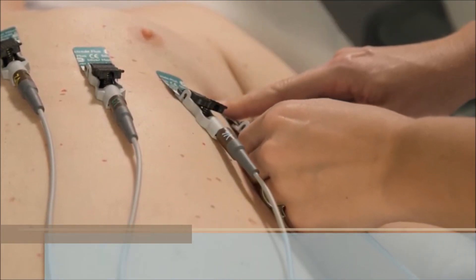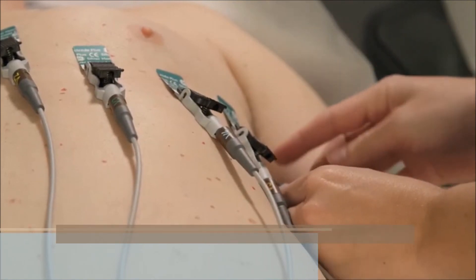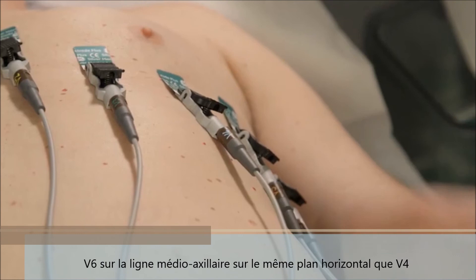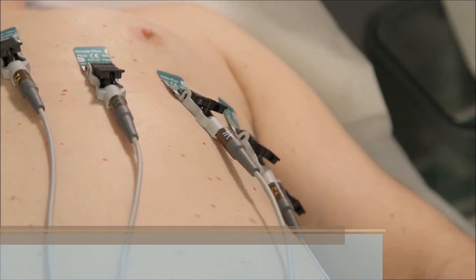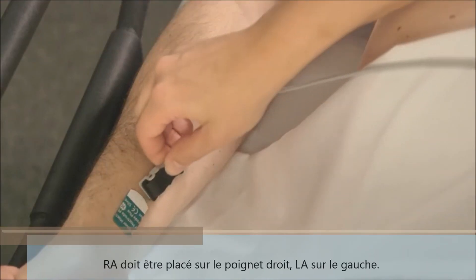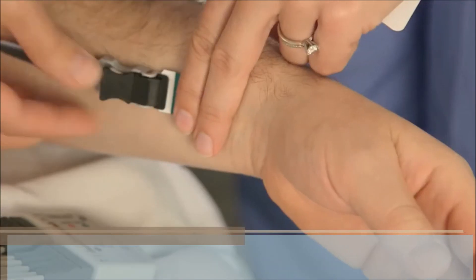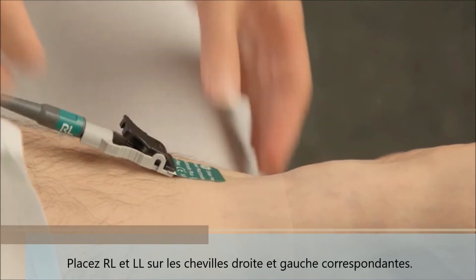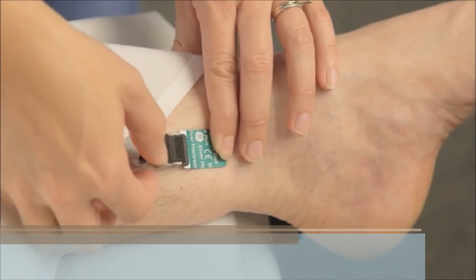Place V5 between V4 and V6 on the same horizontal line. Place V6 at the midaxillary line on the same horizontal level as V4. The right arm electrode needs to be placed on the right wrist, left arm on the left wrist. Place right leg and left leg electrodes on the corresponding right and left ankles.